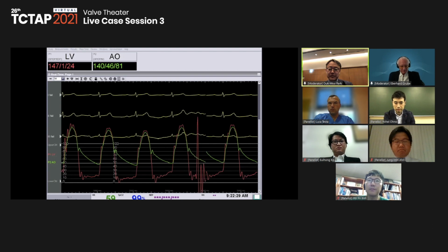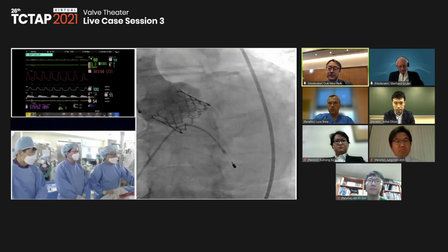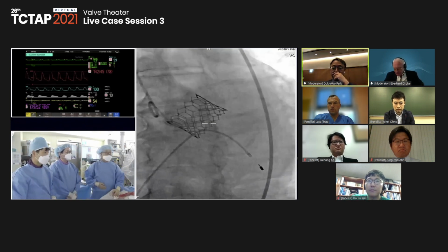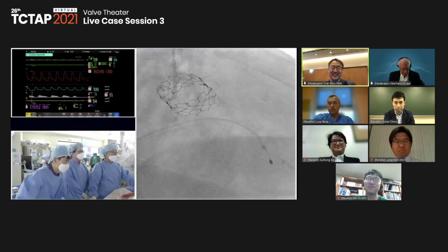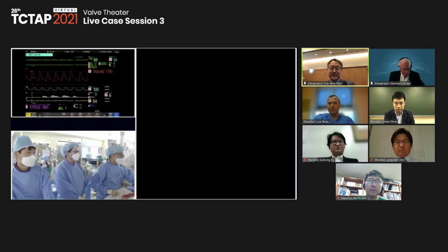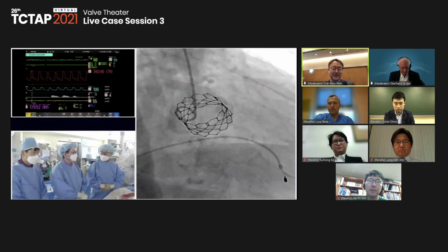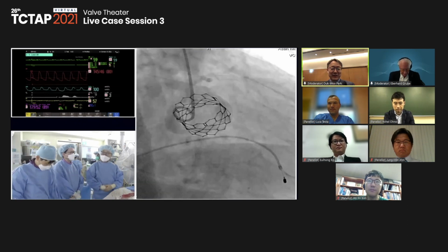Okay, and then the remove. Okay, push up. Great. Absolutely. How much PVR? Less than mild. 0%. And then out of your view, this is very good, how well circularly expanded the valve is. Okay, angio. Push up. Great. How much PVR? No PVR. Okay, zero. So I'm going to stop our first live case demonstration.